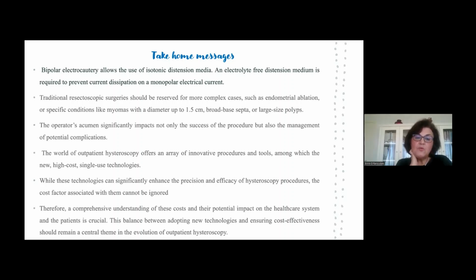The operator's experience significantly impacts not only the success of the procedure, but also the management of potential complications. The world of outpatient hysteroscopy offers an array of innovative procedures and tools, among which are new high-cost technologies.